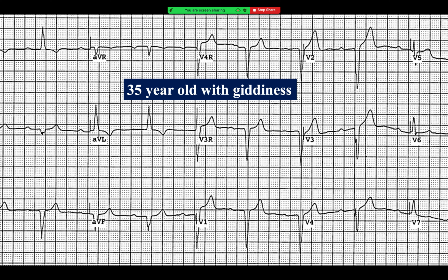What about this one? A 35-year-old female with giddiness. Come on, use the chat box. You know the diagnosis very well. There is left axis deviation.